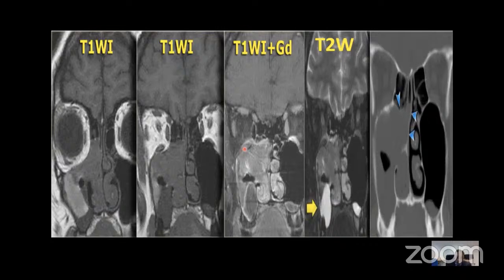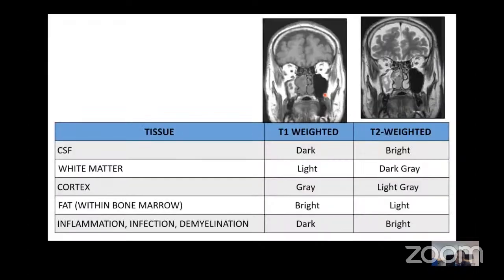When we request an MRI scan, we are given three sequences. One, a T1, a T1 GAD, and a T2 sequence. How do we differentiate between these three, and what information can we obtain from these sequences is the next question. As a layman, I use this table to differentiate between a T1 and a T2.